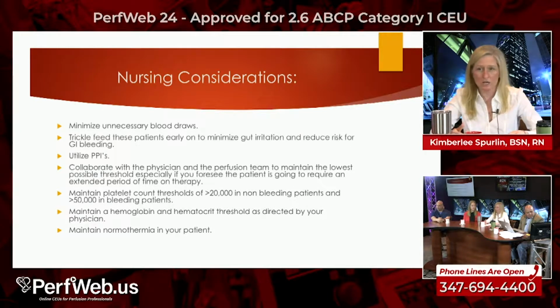Again, that's initiating. And then, of course, when we start talking about weaning and reducing flow, you have to know that balance of, all right, I've got lower flow states. Now I know I need to run a little bit higher. How old is my circuit? So now you're 3 weeks in, and it's the same oxygenator as when you started, and now I'm trying to run it at 2 liters. You may or may not have a problem. Post-oxygenator gases. It's one thing to say, oh, everything's great, we're weaning down, but now you need to see how well is my device functioning. So you need to do that in comparison with what you're doing to give them the best benefit.